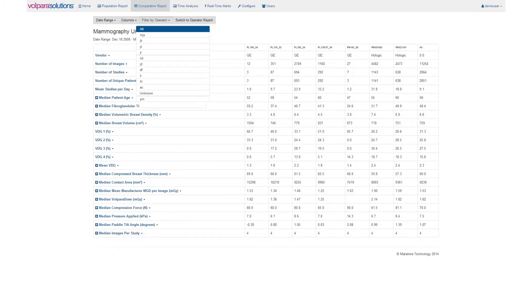Moving across to the Comparative Report tab, you can view data by X-ray unit or switch to the Operator Report. You can select all of the units, individual units, or multiple units that might be at one location, for example. The same goes for the operators. The Comparative Report gives you context to the data and will help you identify opportunities for quality improvements such as system calibration or technologist training needs.